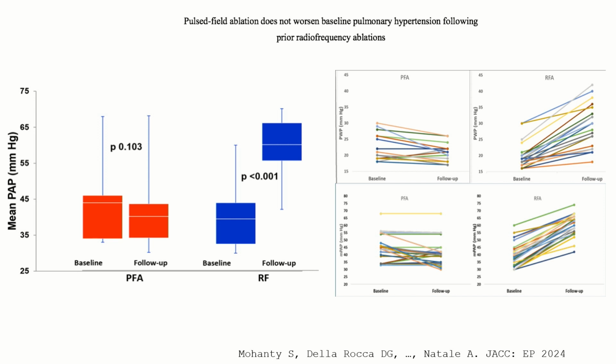Again, a study was published in association with the Austin group and us, showing that PFA does not worsen baseline pulmonary hypertension in patients that had previously undergone radiofrequency ablation.